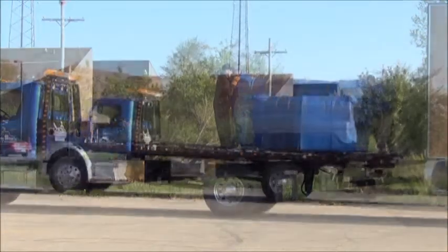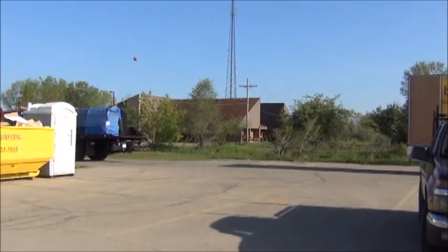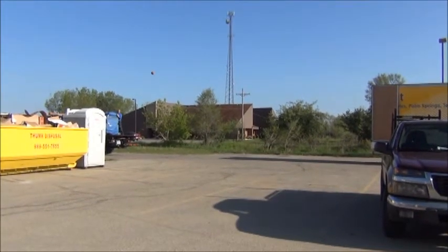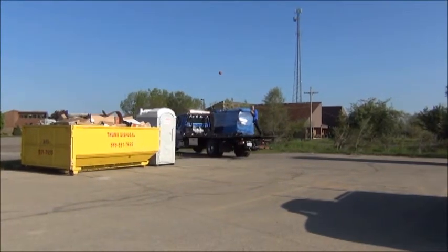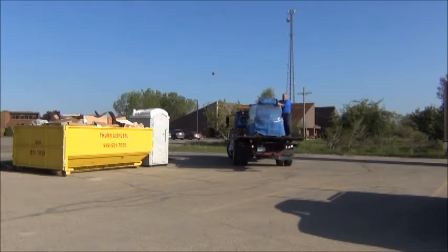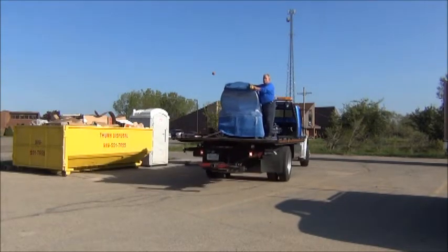On Thursday, May 29th, Huron Medical Center received 2 hyperbaric chambers. Director of the Wound Care Center and Bariatric Center, Pamela Gates, and LPN Hyperbaric Chamber Operator Jenny Anderson sat down with me to discuss the acquisition. A hyperbaric chamber is a 9-foot by 5-foot horizontal cylinder that patients lay down inside.